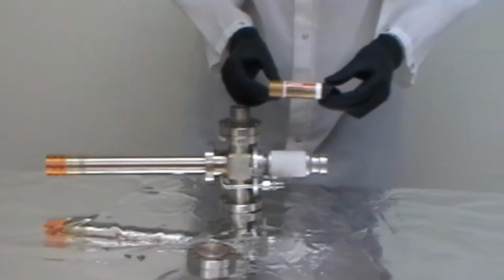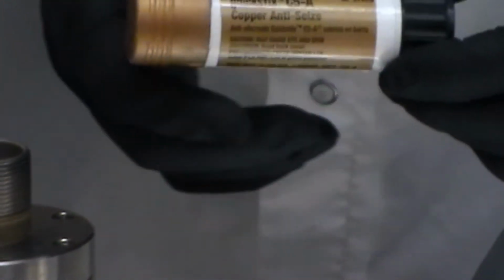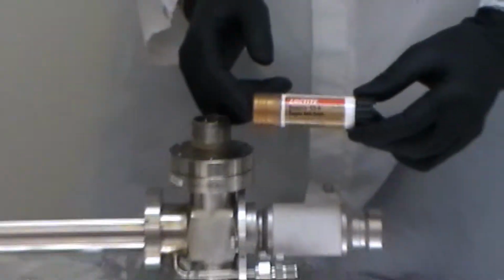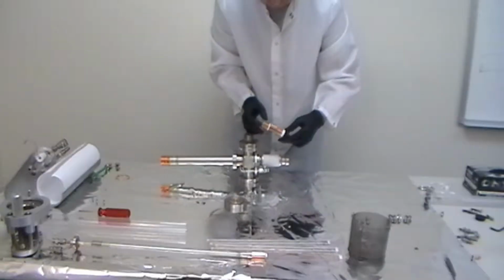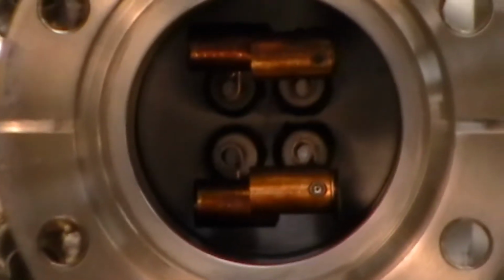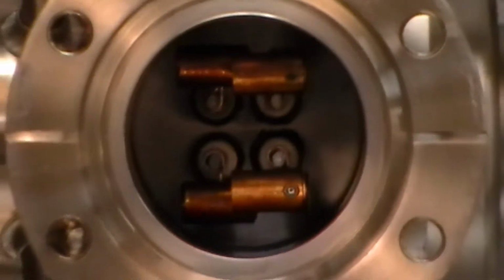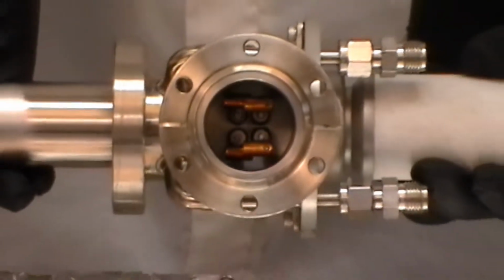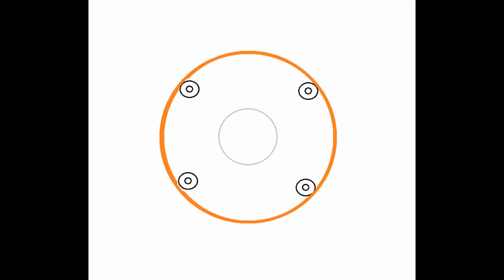We want to maximize the distance between the couplers and the anode. So to do that, you may have to adjust the spacing on these couplers so that they come up or down slightly, so that once you look at them from inside of the tube, they're hugging the wall of the tube. That will give you the maximum distance. Here it shows where the couplers would be if you're looking down from the tube. You want to maximize that distance to prevent arcing to the anode.